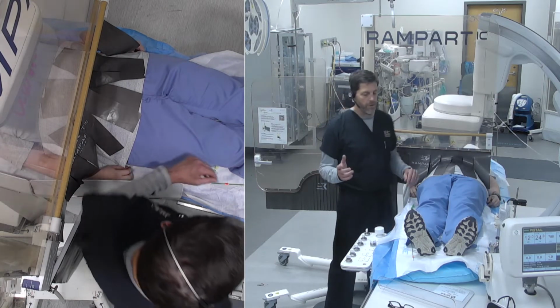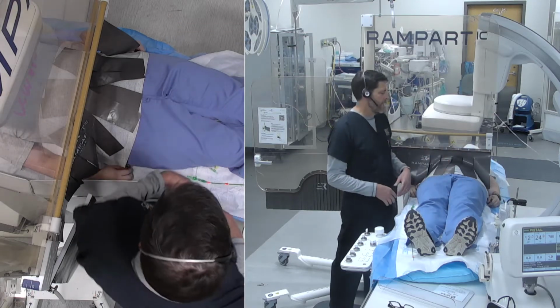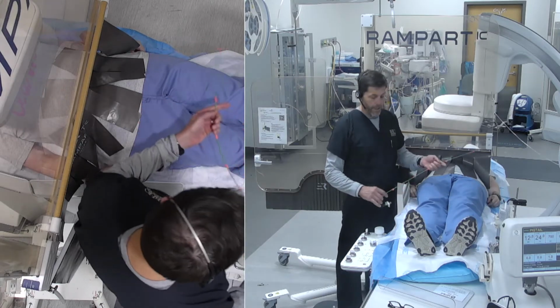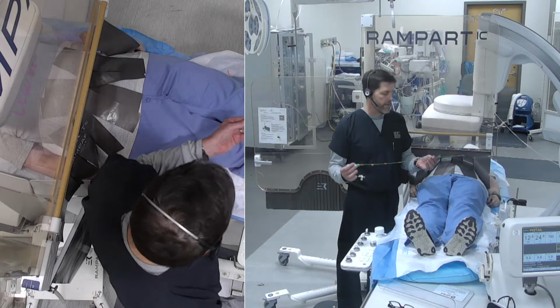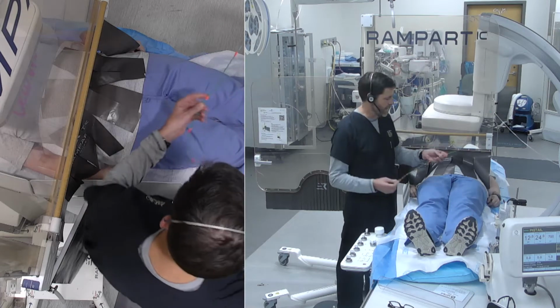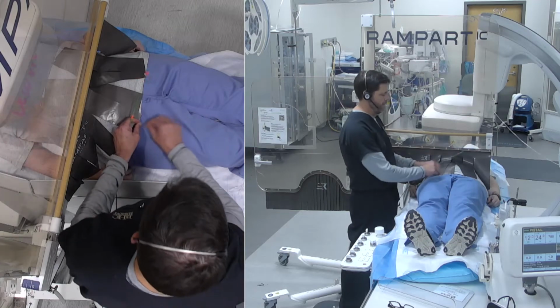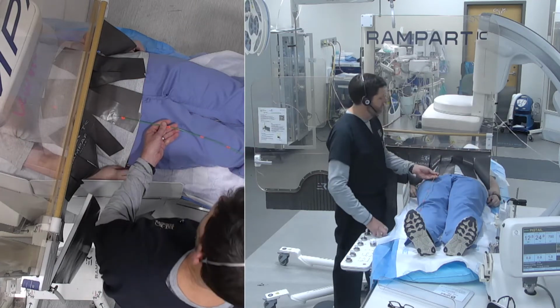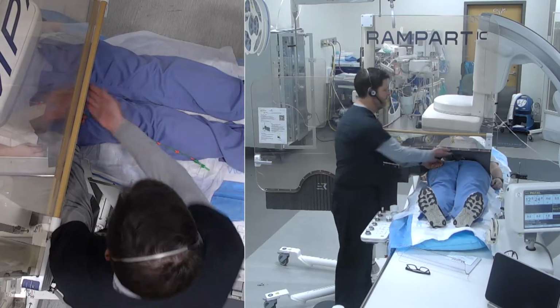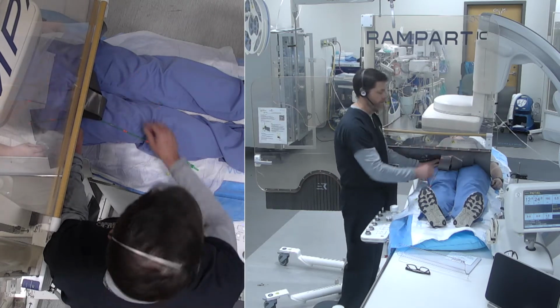So the first thing I want to show you is if we're doing a left lower extremity intervention from the right groin. So typically what I do, and the only difference from what I used to do, I use a slightly longer sheath. So this 65 centimeter destination sheath, I put these orange markers on it just so you can see it a little bit better. And basically I get access, numb up the groin, get my access, and then I just slide the patient in. Then I'm able to see, again, I pull this out and hold my hand in place. I'm able to go up and over to the other leg.